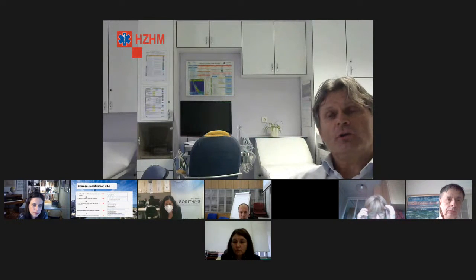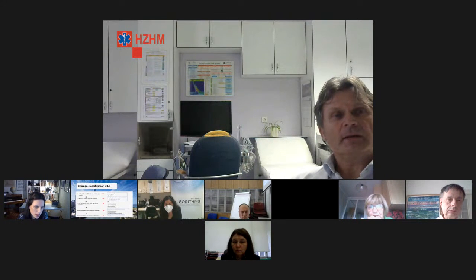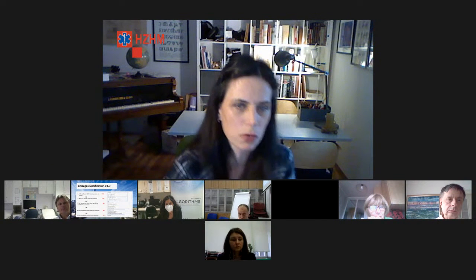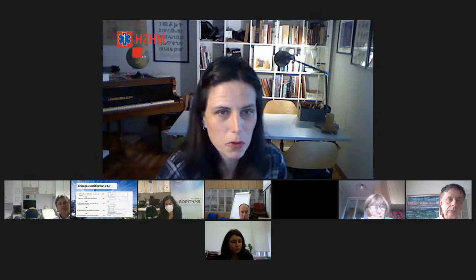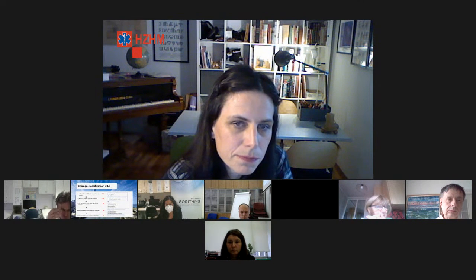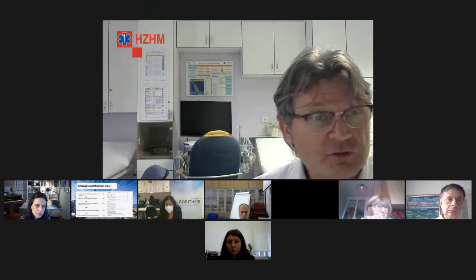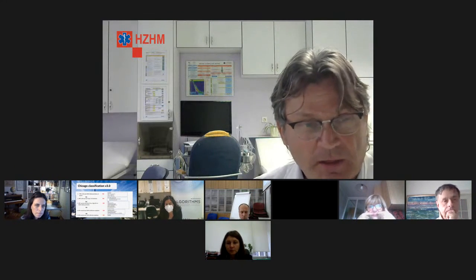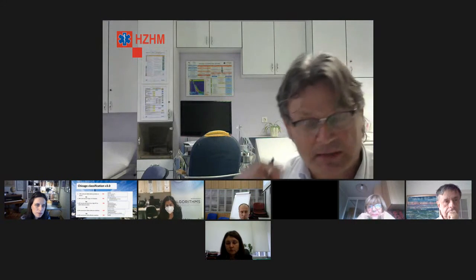Koliko vam traje otprilike solid state kateter? Nama je trajao otprilike 3 do 4 godine, prebacili smo 500 procedura, jer smo ga relativno dobro pazili. Ja sam ga čuvao kao oči u glavi, pa su mi stradali oni mjehurići, poslao sam ga i nikad se nije vratio.